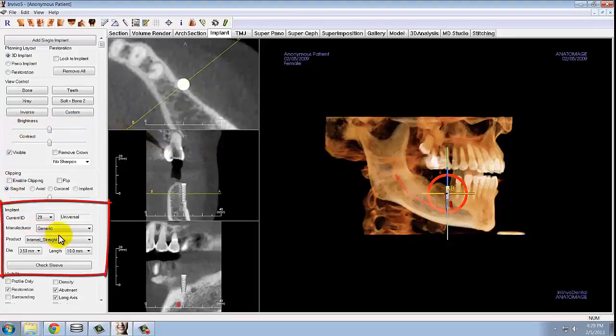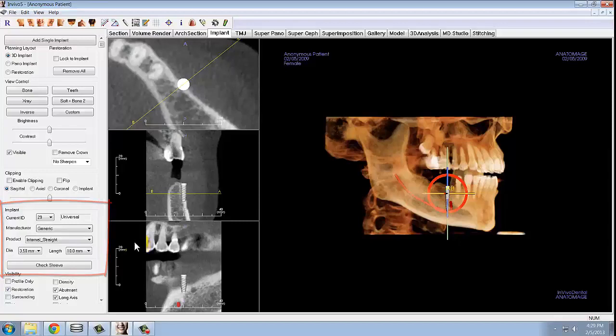Use the manufacturer, product, diameter, and length options in the control panel to select the specific manufacturer that the doctor wants to use for placement.